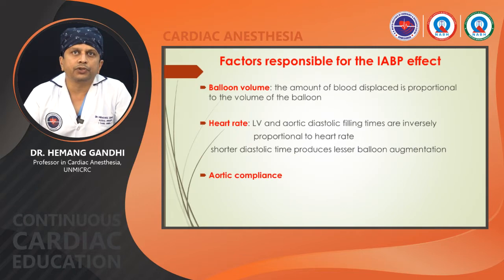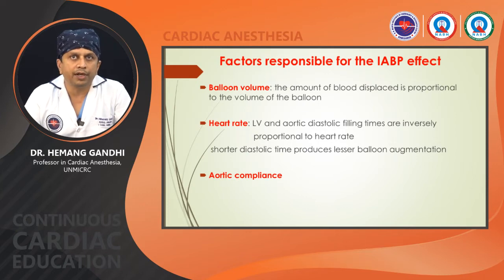So factors responsible for the IABP effects are balloon volume, heart rate and aortic compliance. These three points affect the balloon IABP augmentation as well as the IABP effects. So balloon volume is the amount of blood displaced, which is proportional to the balloon volume.